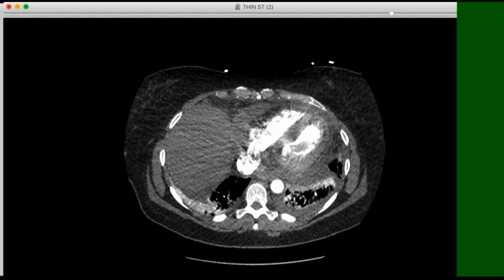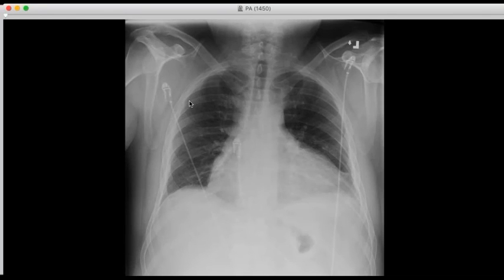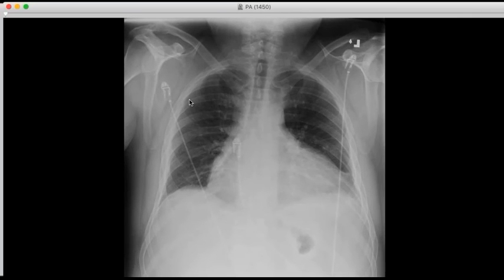Okay, well, let me show the other case of pericarditis and see if that holds true. This one has a radiograph. Hold on, I'm going to switch and show the screen here. So Daniela had the same case, I think, or the second case in the same weekend or same day. I can't remember, but yeah, back to back. So maybe there's something going around.